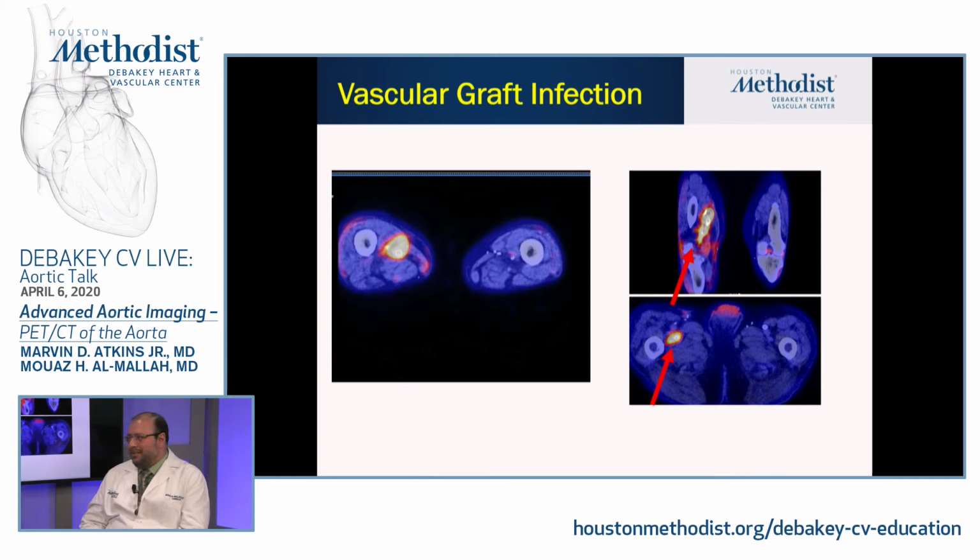And was this done just out of interest to see exactly, or was there some clinical question in this patient? So there was a concern in this patient because he was even an outpatient and was put on antibiotics, and he thought he was feeling better and there was a little bit less erythema, although there is clearly an infection. So the question was, with the infection, how bad is it? Can we wait on it, or does it have to be done? Because this patient even had some antibiotics first.